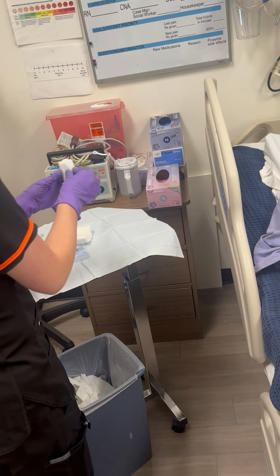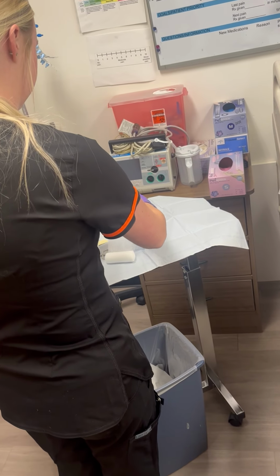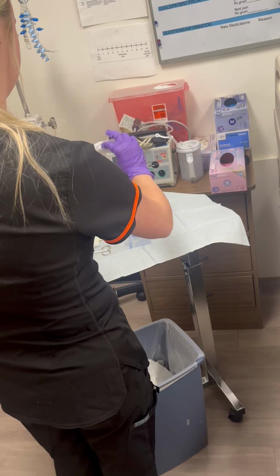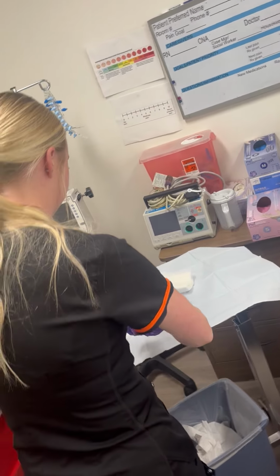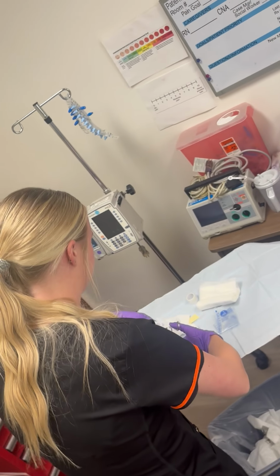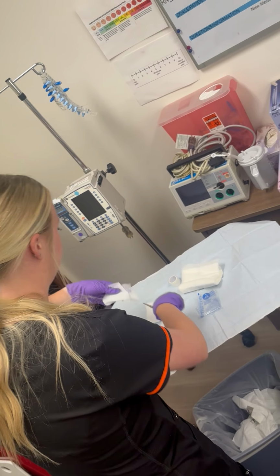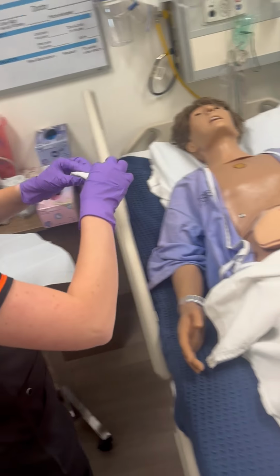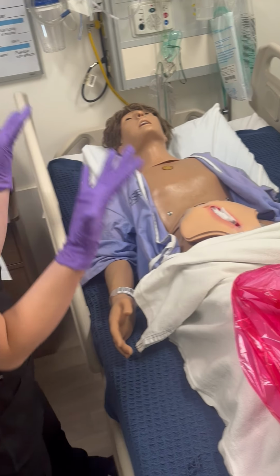Okay. To pack my wound, I'm gonna grab some of this extra gauze that I have. Actually, I'm gonna use my roller, and I'm gonna grab just a little bit of it so that it's nice for my patient. And we're gonna cut that. Make sure that we don't do anything unsterile. We're gonna tuck that and we're gonna pack the wound.